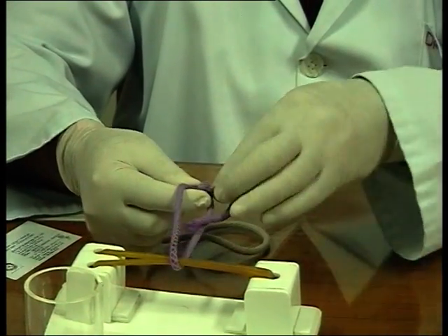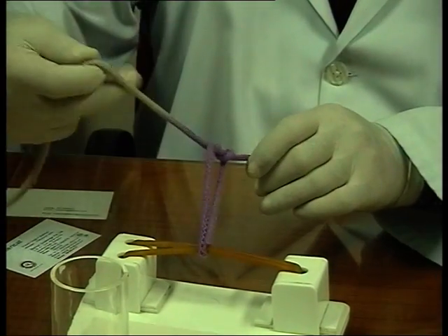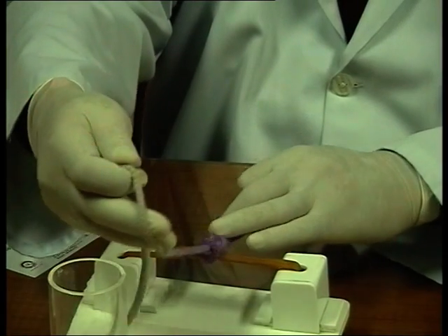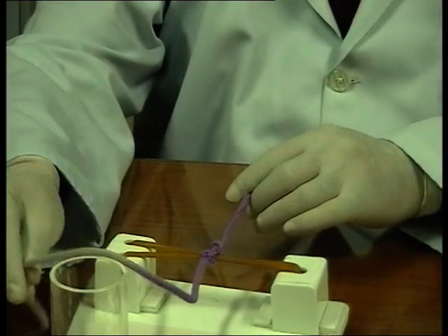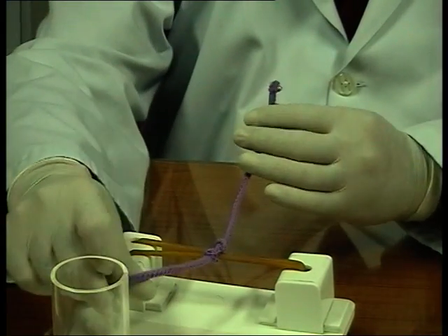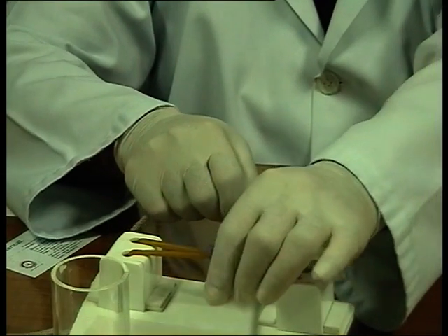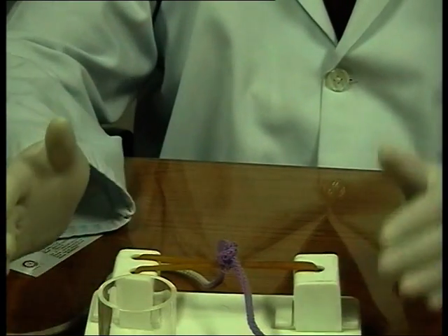Draw this thread out once, twice, and cross. Okay? Clear? And then I'll hold it like a dot, just opposite of what I did with my right hand, cross back. That becomes left-handed surgeon's knot.